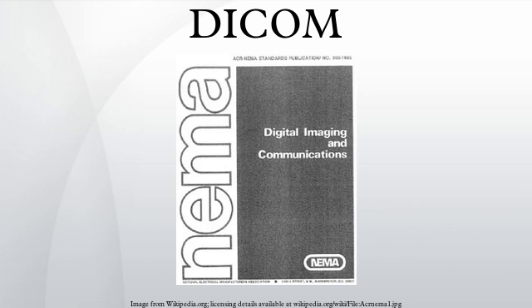Loral Aerospace and Siemens Medical Systems led a consortium of companies in deploying the first U.S. military PACS at all major Army and Air Force medical treatment facilities and teleradiology nodes at a large number of U.S. military clinics. Dejarnette Research Systems and Merge Technologies provided the modality gateway interfaces from third-party imaging modalities to the Siemens SPI network. The Veterans Administration and the Navy also purchased systems off this contract.